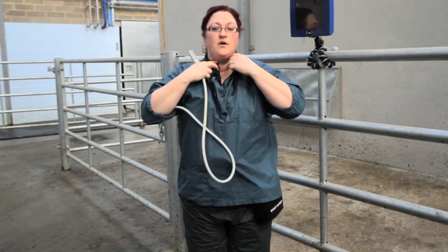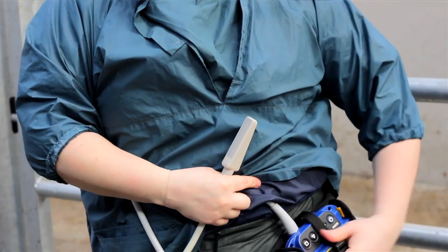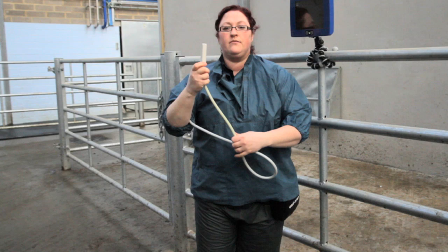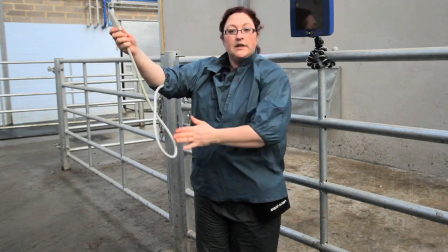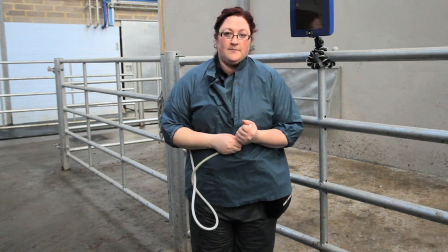Now we have our waterproof top, we've covered over the console, and we're at less risk of the ultrasound probe flapping around and potentially becoming damaged.